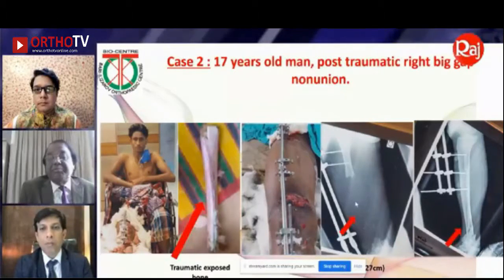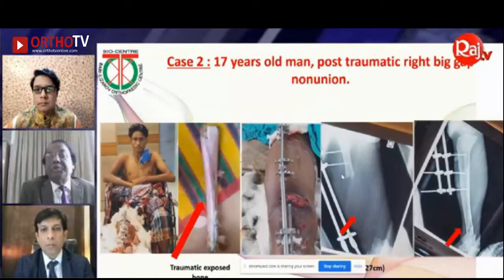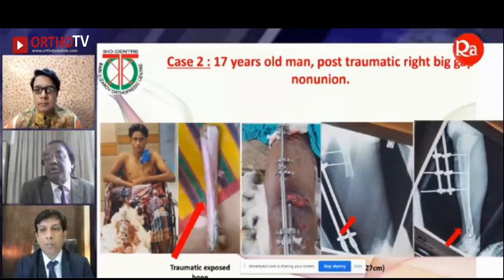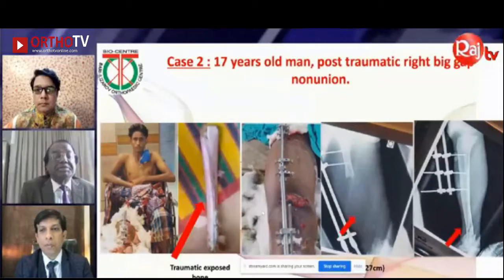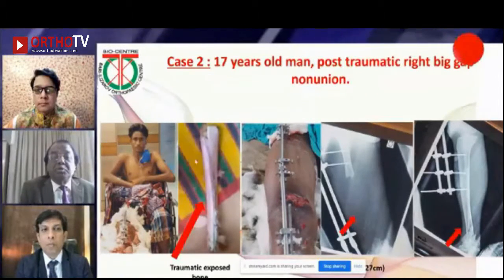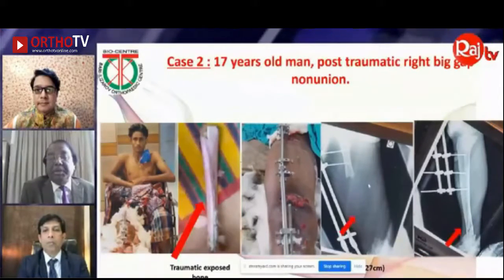He was in another place. They advised him to go for amputation. And here, lower part of the pilon fracture and lower tibia. You can see here in the ipsilateral. So, young chap, look at the face. It is open. No femur here.